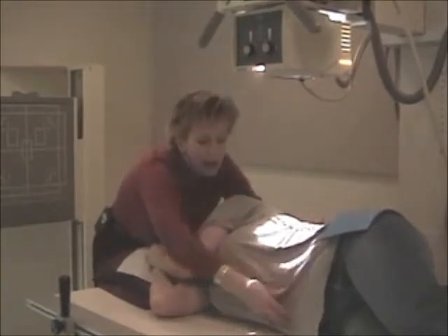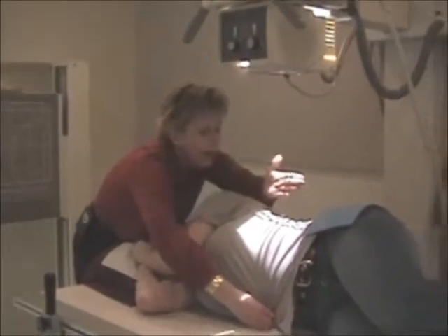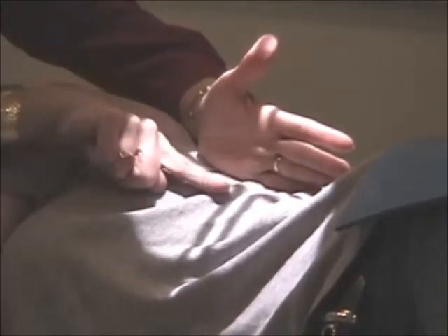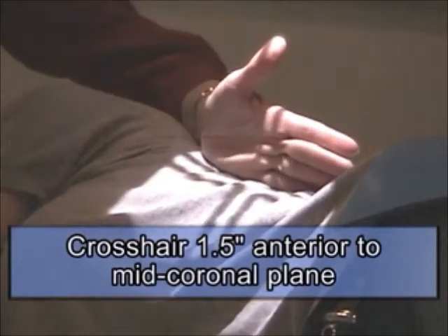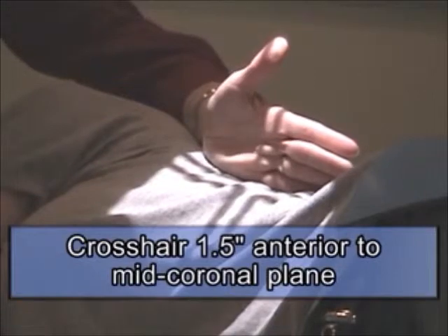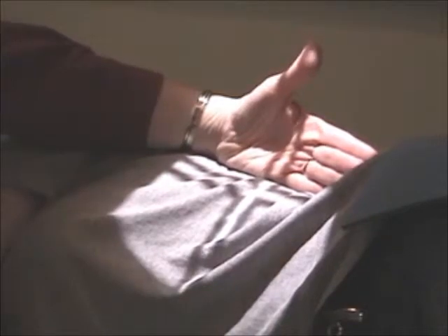Now, the front and back plane, I'll try to tighten her sweatshirt here a little bit. And her mid-coronal plane, I'll try to demonstrate it with my hand right here. There's her mid-coronal plane. I'm going to want the crosshair approximately 1.5 inches anterior to the mid-coronal plane. So I'm going to come around and float the tabletop backwards a little bit. Mid-coronal plane, and you want to be 1.5 inches anterior.